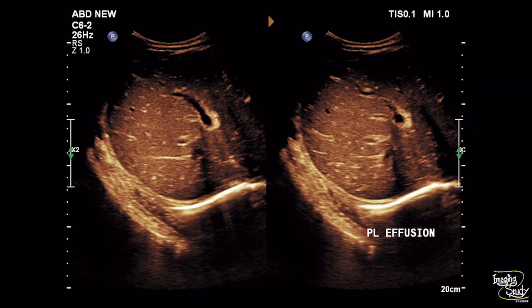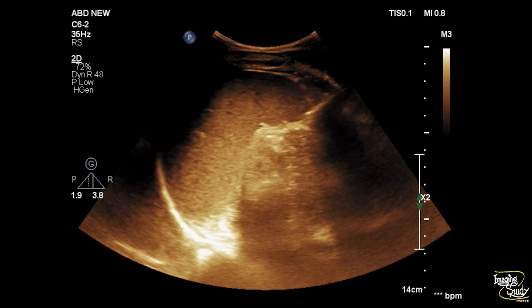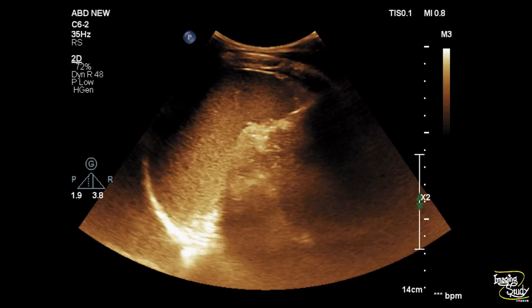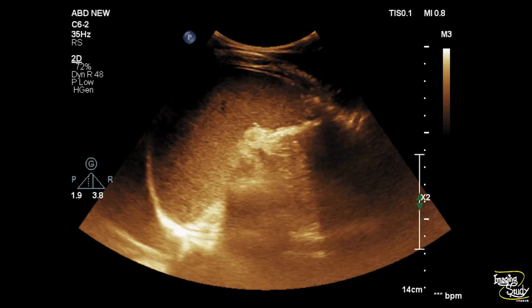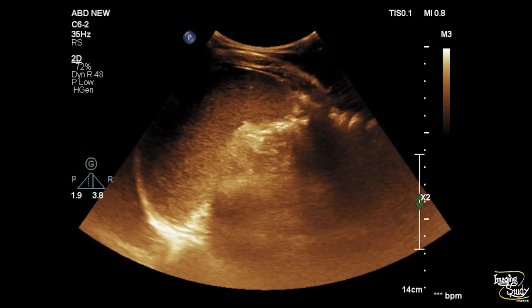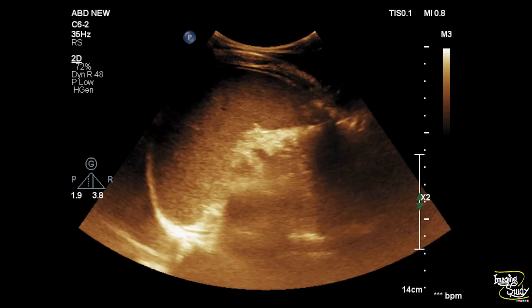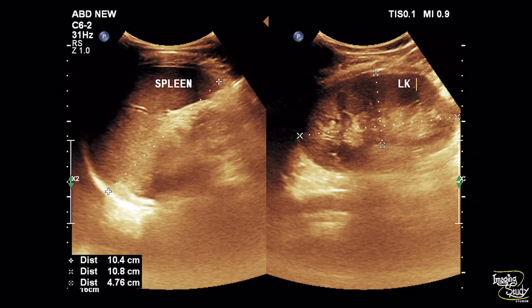Here is the pleural effusion; you can see some collection above the diaphragm. Now come to the spleen. The spleen looks quite normal and we have measured it at 10.4 centimeters in length, which is approximately normal. But given the body status of this 16-year-old patient, 10.4 centimeters looks quite prominent to us.